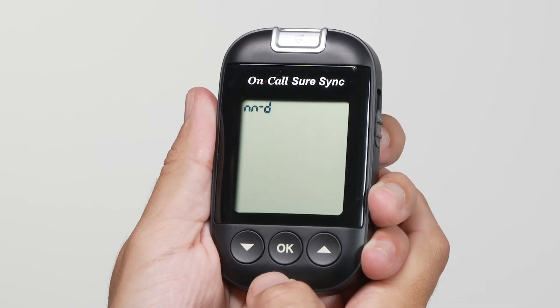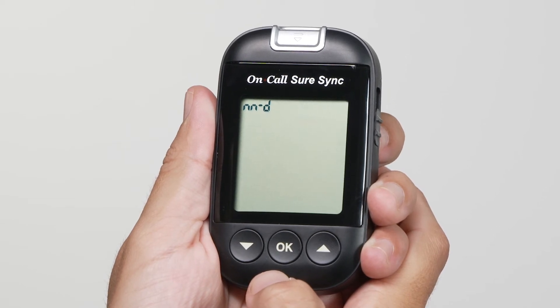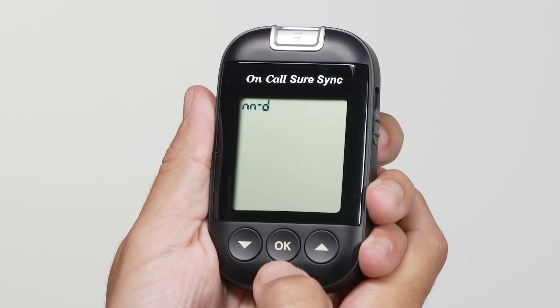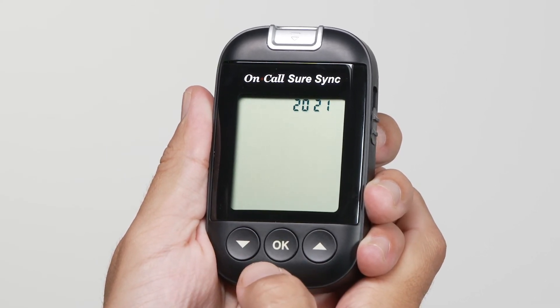Next, set the date format to either month/date/year format or a date/month/year format mode. Press the down or up button to switch between the two settings. Then press the OK button to save your choice and then start setting the year, month and date.